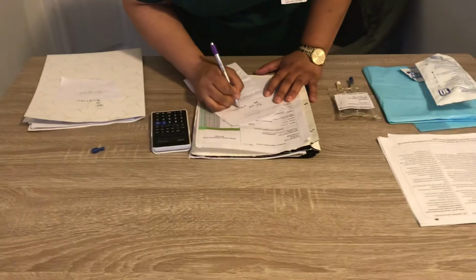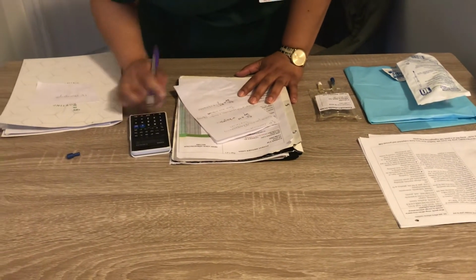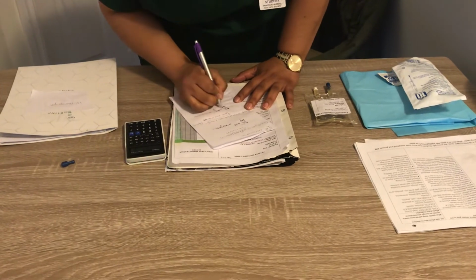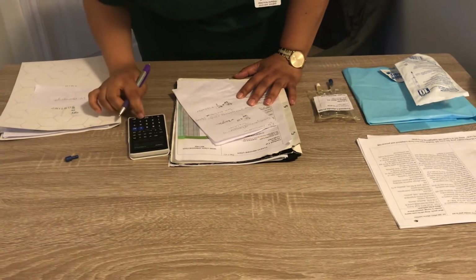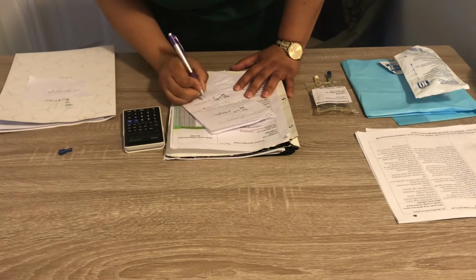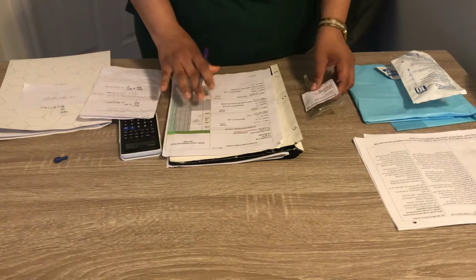And that's giving 20 GTT per minute. And next, I'm going to calculate by pump. And that's giving me 120 mils per hour. So after that, I'm going to do my third check.